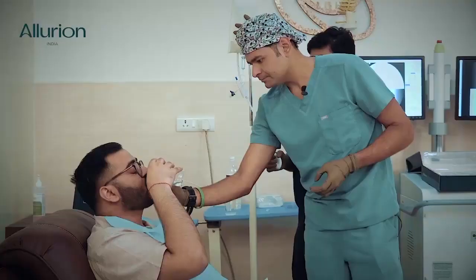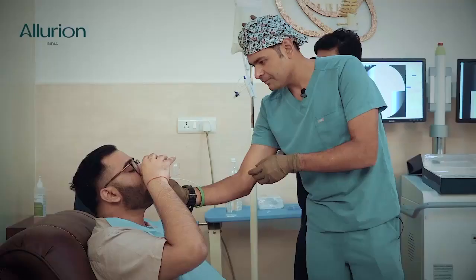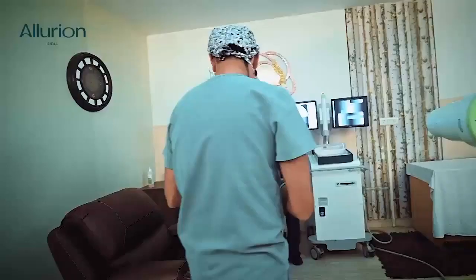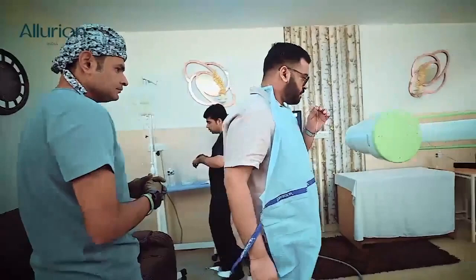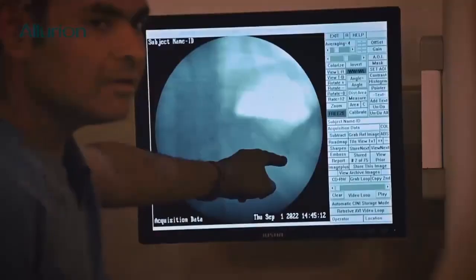Open your mouth, put your tongue out. Start drinking — drink completely, take the whole water inside. Very good, very good, it's gone. Now I'll remove this catheter and we'll take an x-ray. This catheter has come inside your stomach, so we know that this particular balloon is inside your stomach.